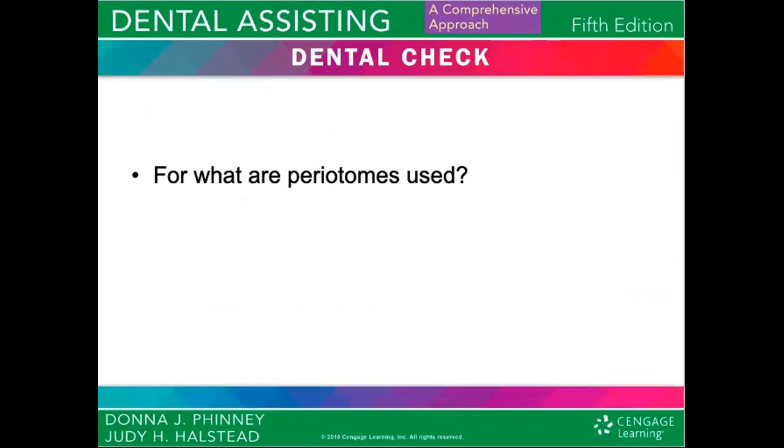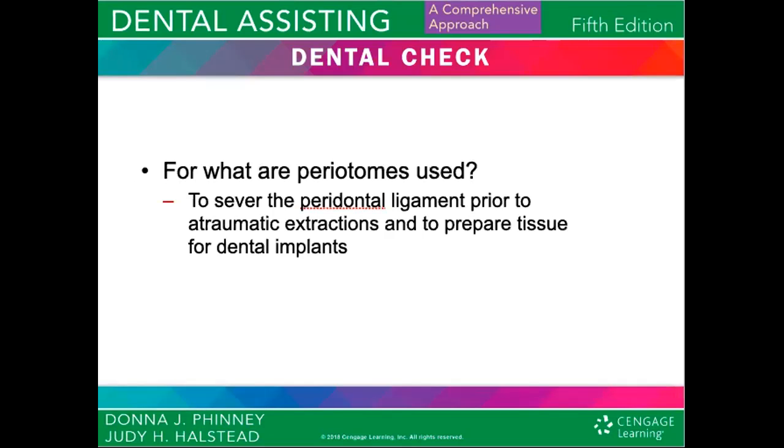So for what reasons are periotomes used? If you can remember a little earlier in our discussion, they are used to sever the periodontal ligament prior to atraumatic extractions and to prepare tissues for dental implants.